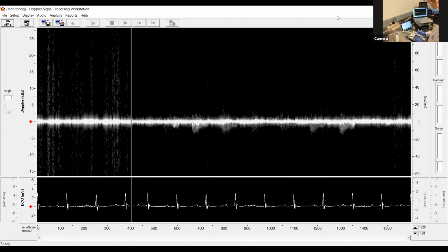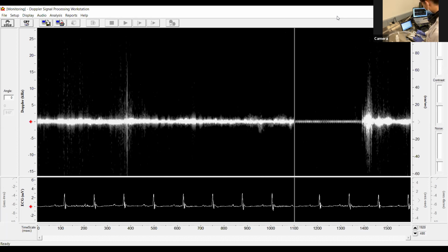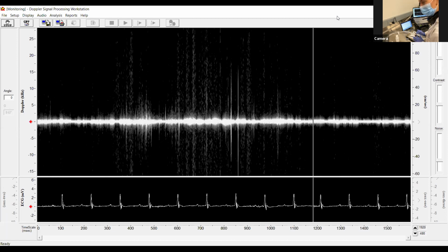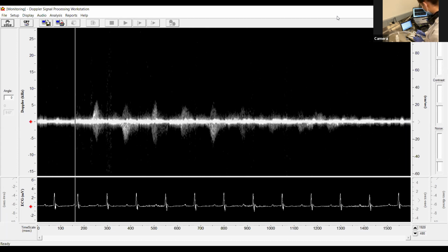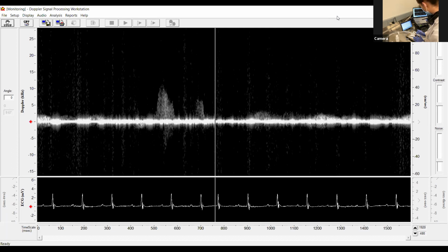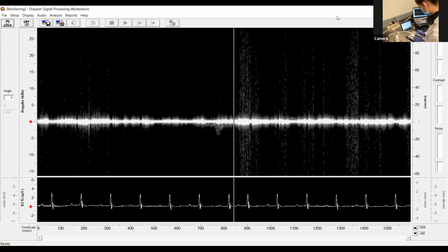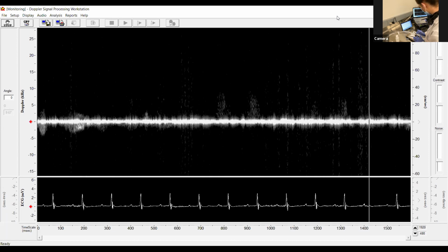How we do this is we make this measurement both when isoflurane levels are high and when they're low, and we take the ratio between those. We'll show you a bit later, if time allows, that there's a micro positioner that would allow the probe to be held in position. It clips onto the side of the platform and holds the probe stable so that as you change the isoflurane levels, you can watch and monitor the change in peak velocity of the coronary signal.